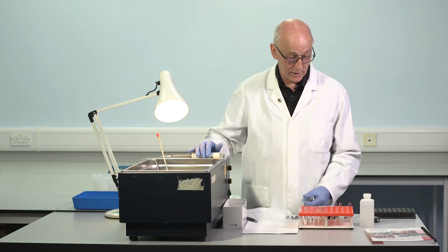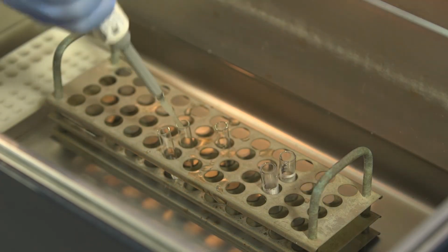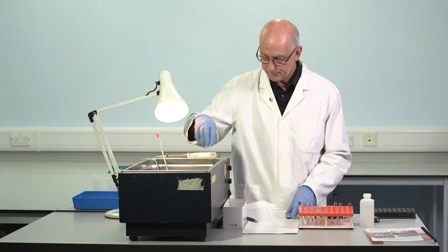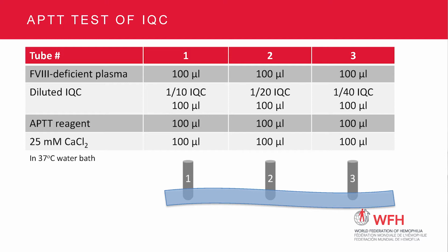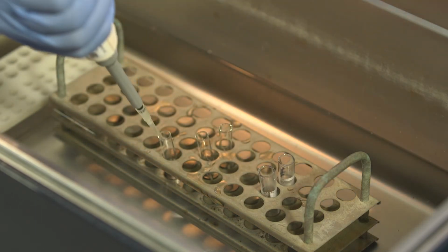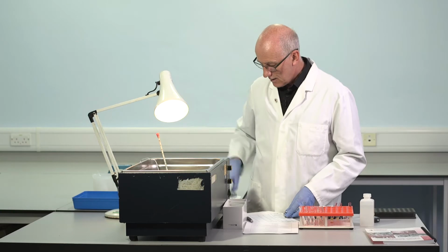15 seconds, 3 minutes, 15 seconds. Calcium to the second tube, start a second stopwatch, and mix. 30 seconds, 3 minutes and 30 seconds. Calcium to the third tube, start the stopwatch, and mix.